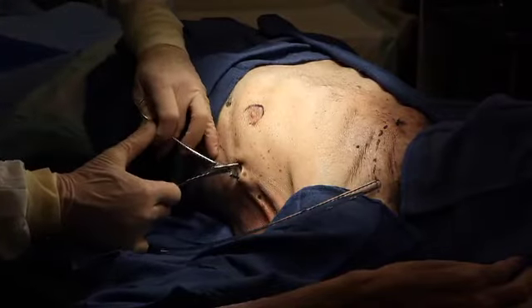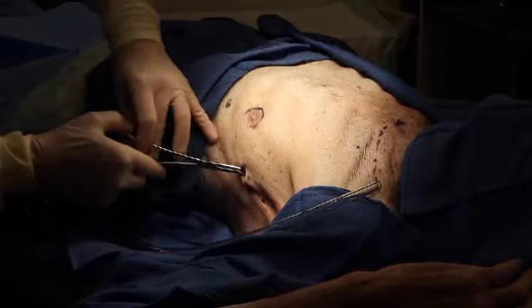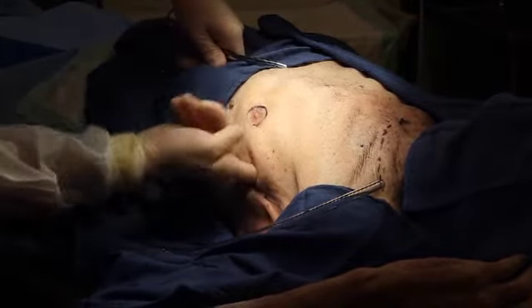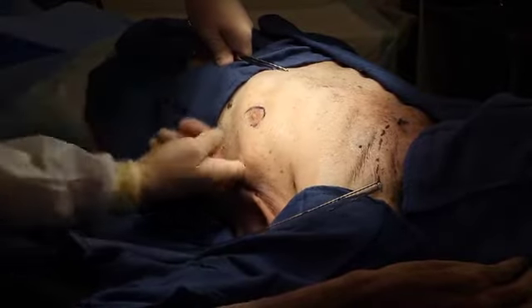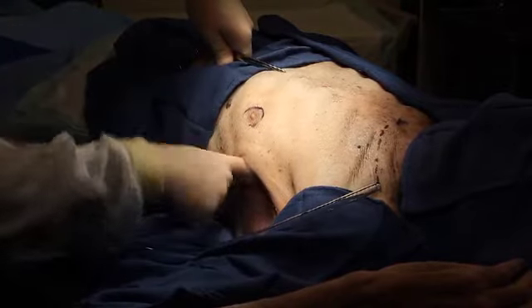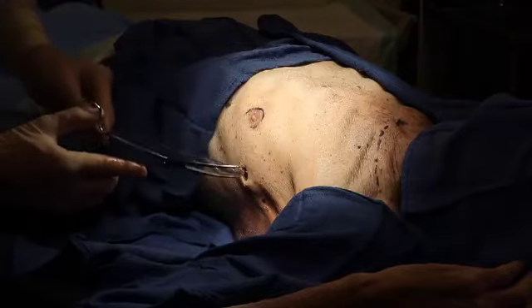While withdrawing the clamp, spread the tips in the intercostal and chest wall muscles to create a hole large enough to admit the operator's gloved finger. A gloved finger is placed into the chest cavity to assure that the chest has been entered and that any adhesions of lung tissue to the chest wall are swept free to allow easy insertion of the chest tube.